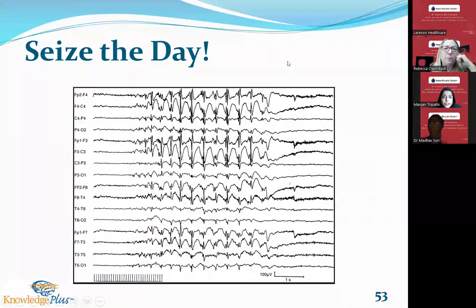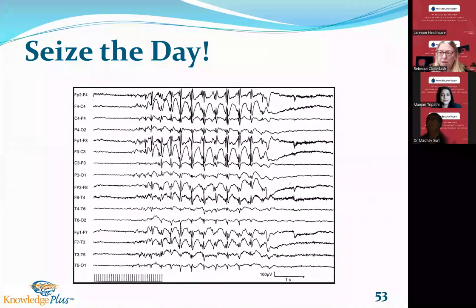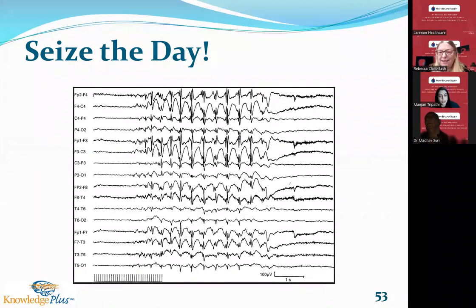There's one question: can we do an EEG showing epileptiform discharges without activation? This is by Eugene Shamba. I think he's maybe from... Suppose an EEG is showing discharges prior to the hyperventilation, would you still want to go ahead with the hyperventilation?